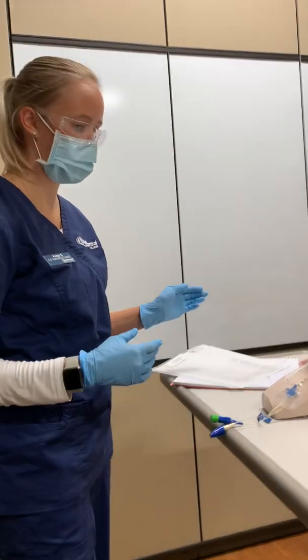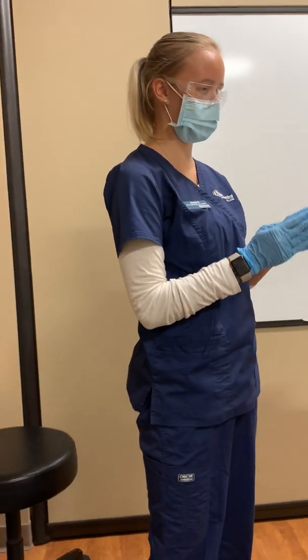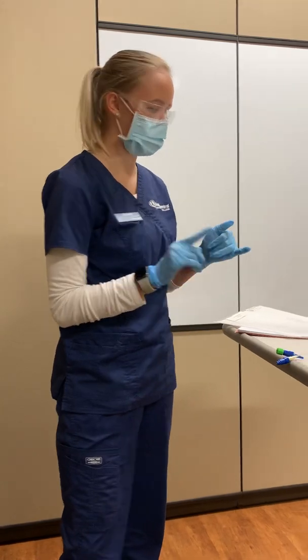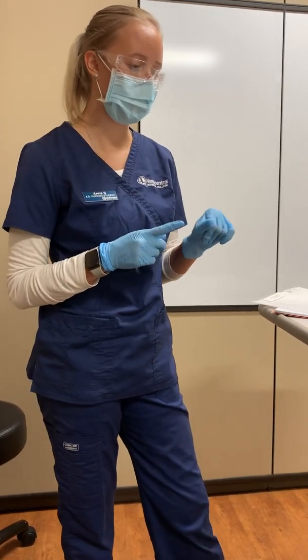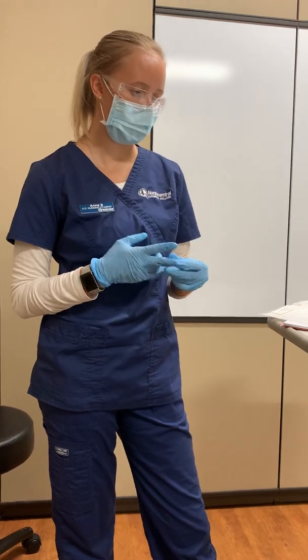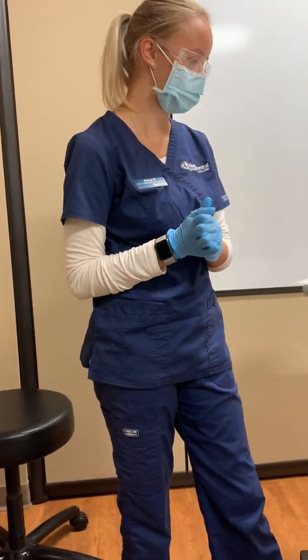And then I would clean up all my supplies, take off my gloves, wash my hands, and make sure that she's comfortable and safe, with the bed in the lowest position. So I'd raise her up and she has her call light. Afterwards, I would document the date, time, what I gave her, why I gave it to her, how much normal saline I used for the flush, and where I gave it, so in her central line.